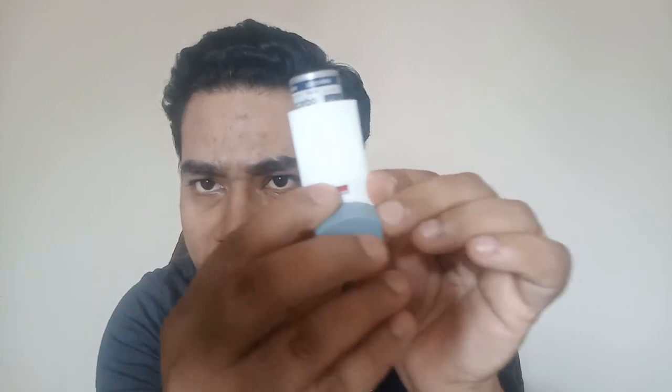Now coming to this inhaler. In some inhalers, you will get a reading. Here is a reading. It shows 0, 120, or 100. When you initially buy this, it shows a reading of 120, and then as you go on using this, it comes to zero. When it comes to zero, you know that all of the medication or drug has been finished, and it is no longer required to use this.